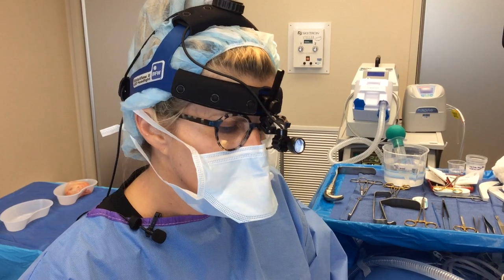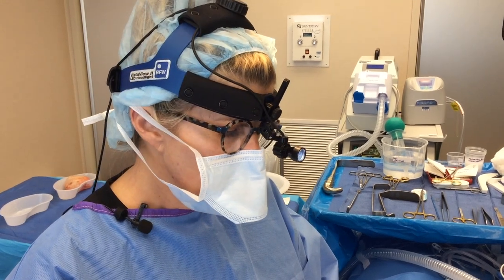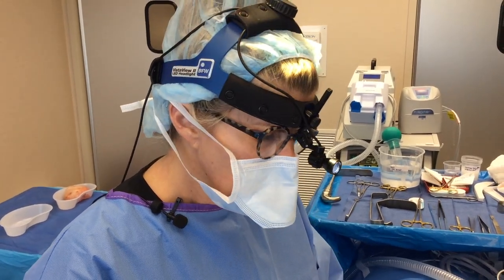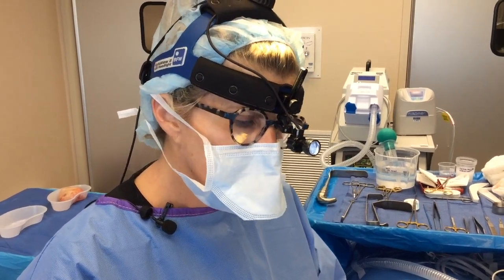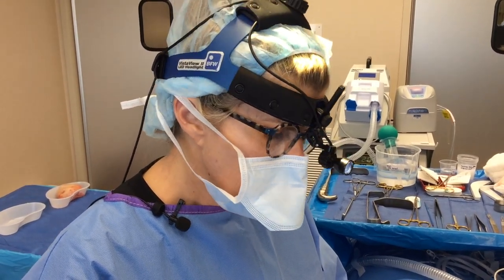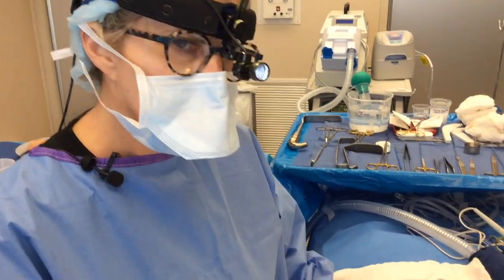Good morning Minneapolis St. Paul. I'm Dr. Jennifer Harrington and I'm doing a really interesting education case this morning. I'm taking implants out for a patient that is concerned that she has breast implant illness. A big part of that is taking the implant out with the capsule, ideally en-bloc if you can. She's also a patient that wants a breast lift, so that can be somewhat of a difficult operation, and it's really important that you go to a surgeon that knows what they're doing.